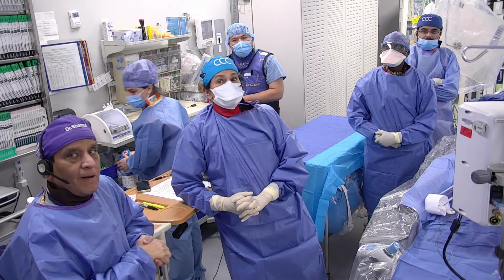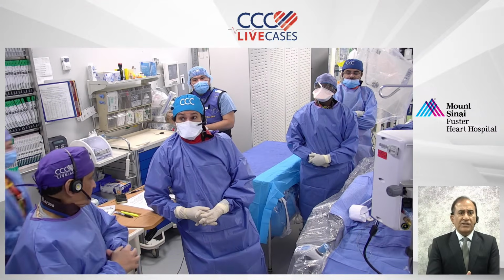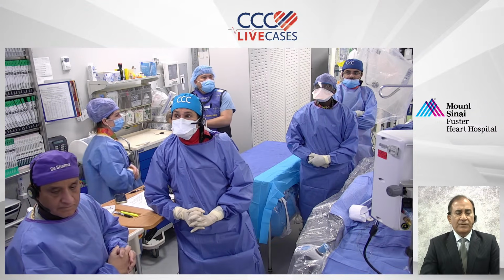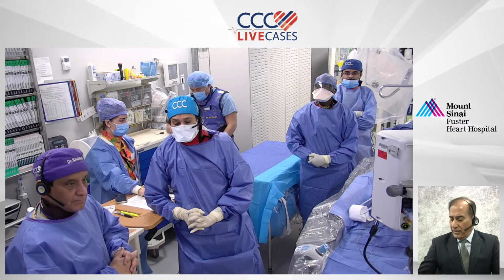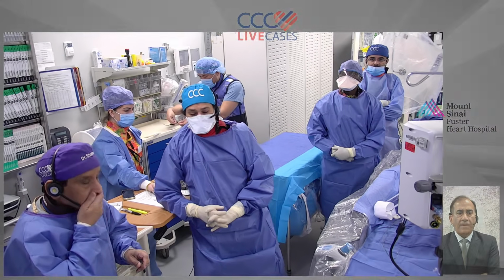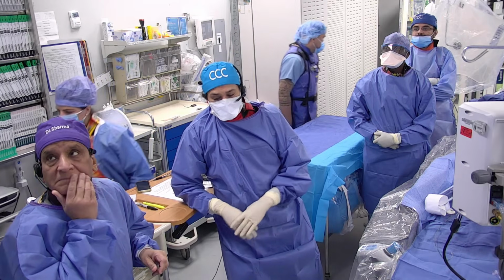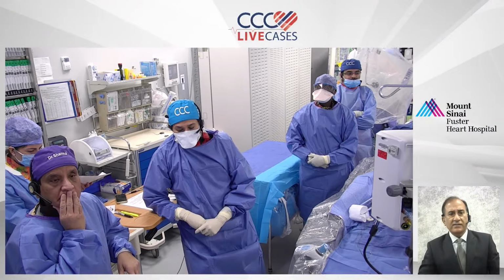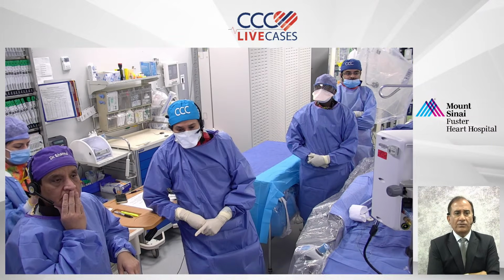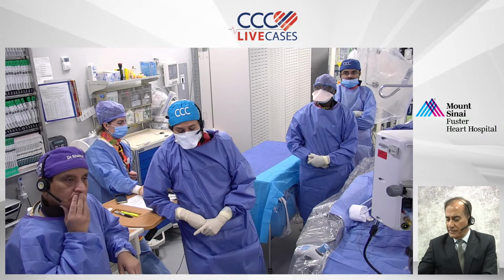Next, second question: in the impeller for STEMI, they were all placed before the PCI? Yes, that is a key. What happened is as soon as the patient comes in, they get an impeller and then they get randomized. Right, which also raises the point that these are not the cases where you chase a door-to-balloon time; these are patients with such high mortality with or without devices.